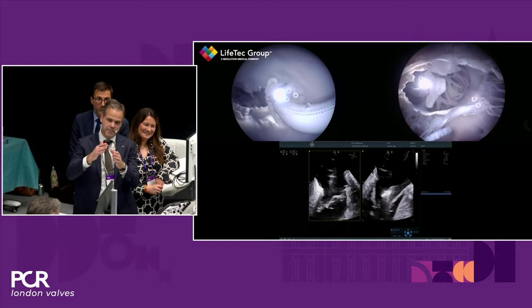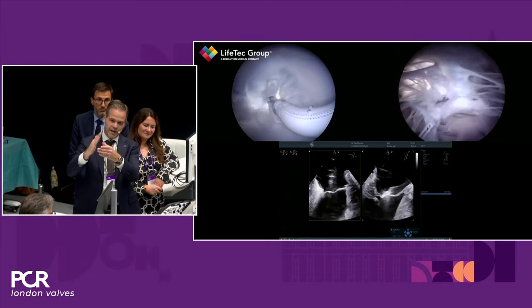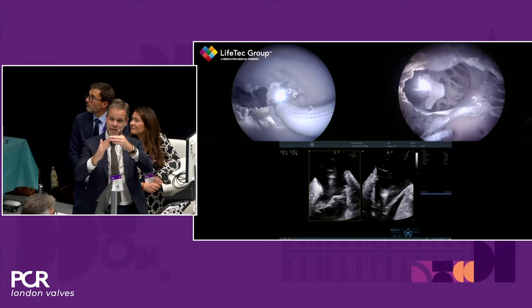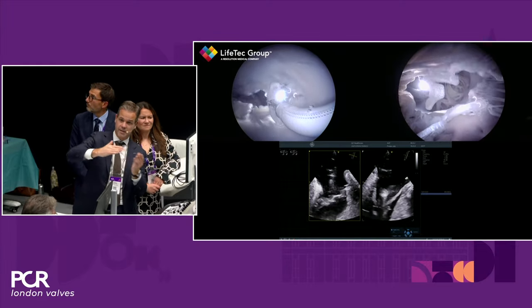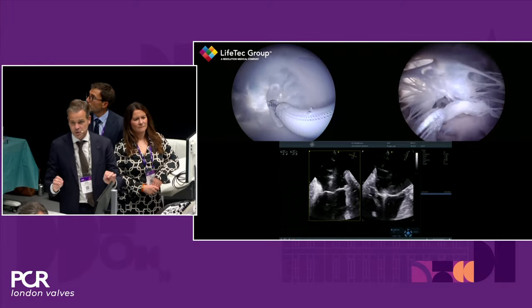So it's nice when the clip is still attached to the system itself. But if you dive in with an angulation, first of all, you can get into the chordae. But also the problem is that when you release the device, it has a tendency to tilt down. Then you make it even worse. So being aware of that, paying attention to that, I think is a crucial first step.